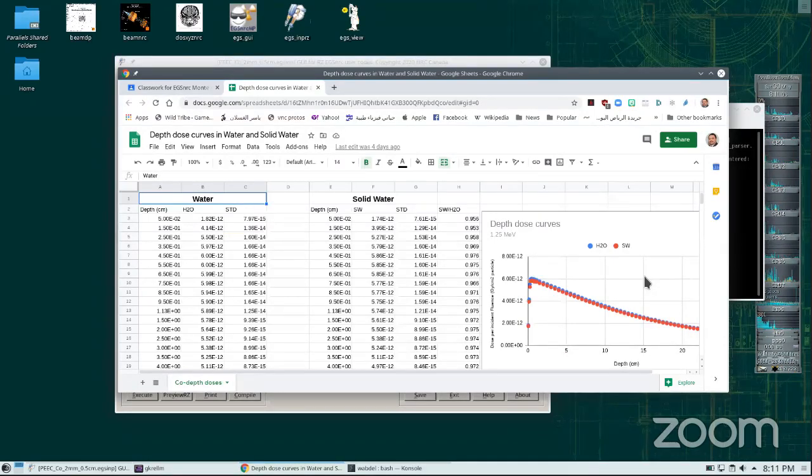Okay. So we cannot, for example, measure the dose in solid water and say, okay, that's the dose in water. Especially when we want to calibrate. Companies, they can promote their product and say, oh, solid water is water, TG51 equivalent. That's when it came out. It's TG51 equivalent and so on.